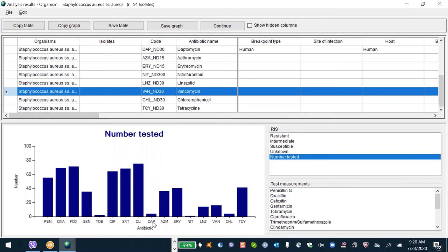So I also mentioned earlier the idea about Ethiopia, all laboratories. I also mentioned the concept of doing a minimal list. And as you can see here, they test a little bit of Tobra, a little bit of daptomycin, a little bit of nitrofurantoin for the urines, a little bit of chloramphenicol. And as you can see, they do take a lot of space. If I'm having a minimal list, there's just not a lot of data for certain things. Like daptomycin, my guess is sometimes it's only one laboratory, they only do it for confirmation. So I would have Ethiopia, all hospitals, all antibiotics, so I could do everything. But if I'm doing my annual report, I don't put everything. In my annual report, I just put the most important drugs. So that'd be one use of a minimal national configuration. I would exclude the daptomycin.